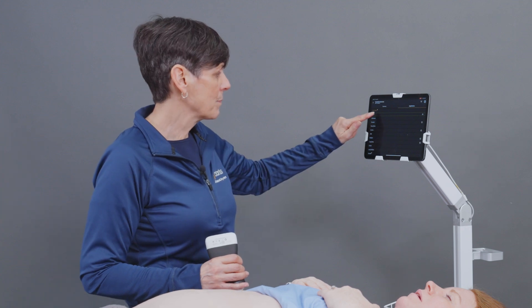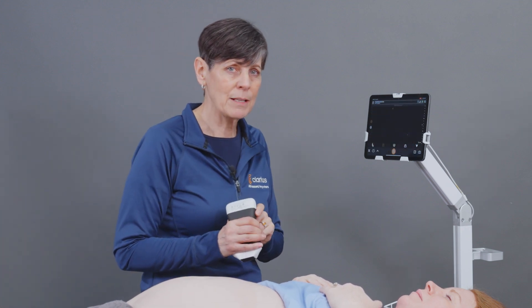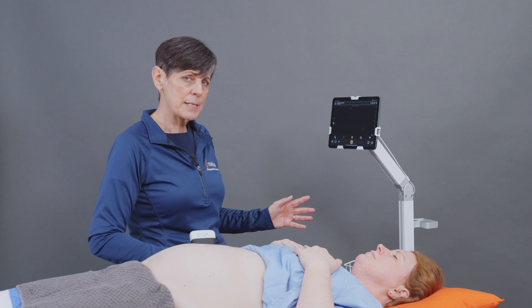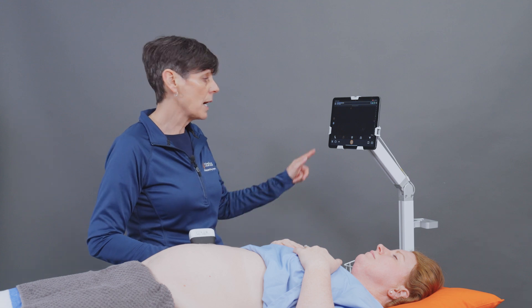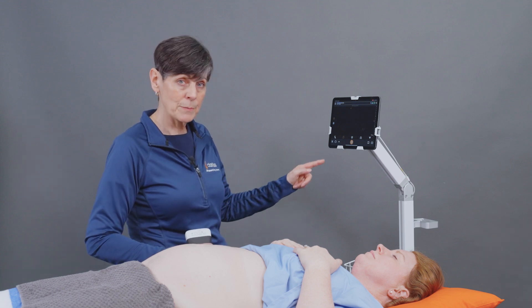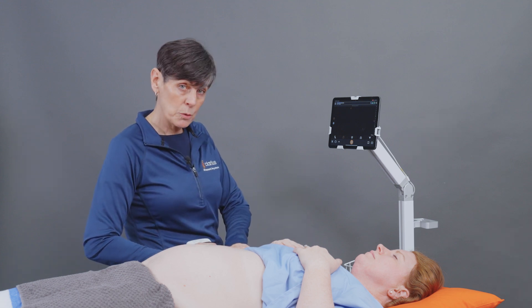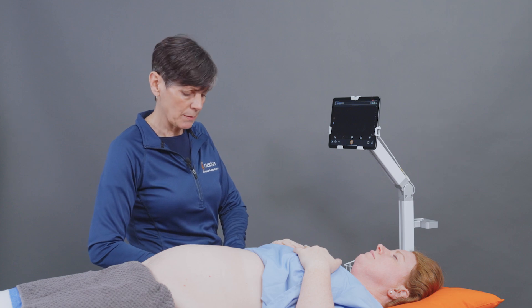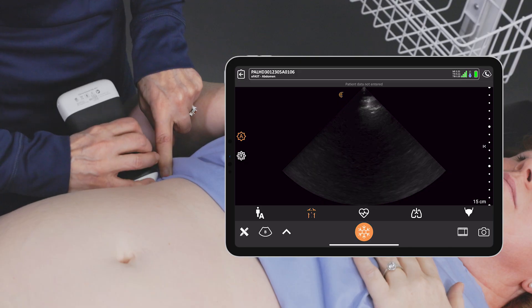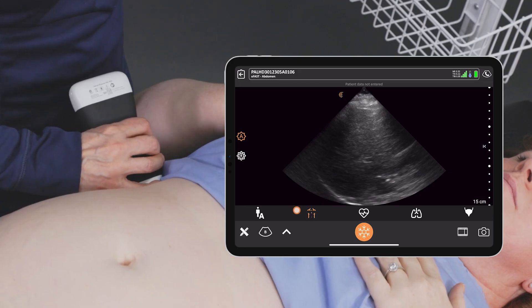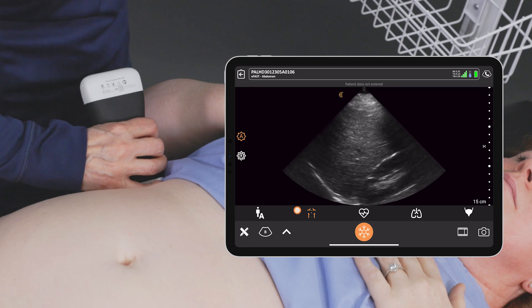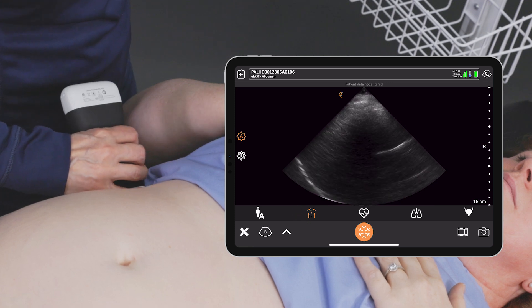We've created an eFAST preset and I'm going to select that using the PAL phased array linear scanner. In the eFAST preset, you'll see icons at the bottom of the screen and those correspond to the areas where you'll be scanning. I'm going to start in the right upper quadrant and select the abdomen, which is going to optimize my image for abdominal imaging.